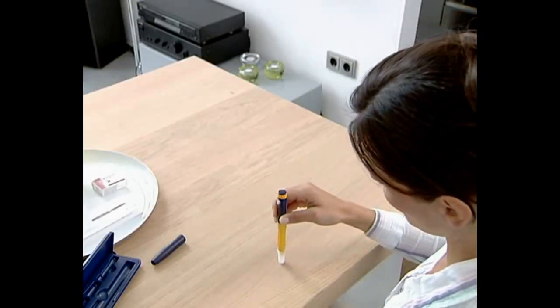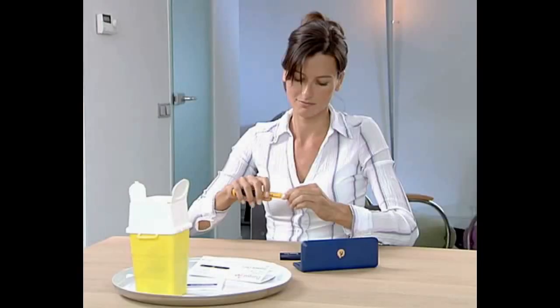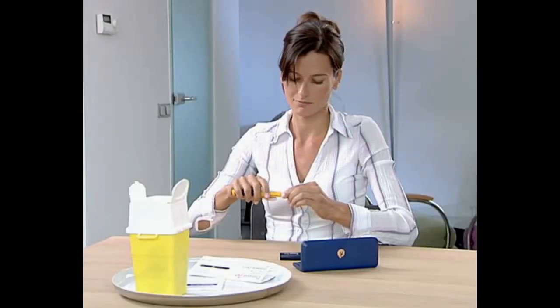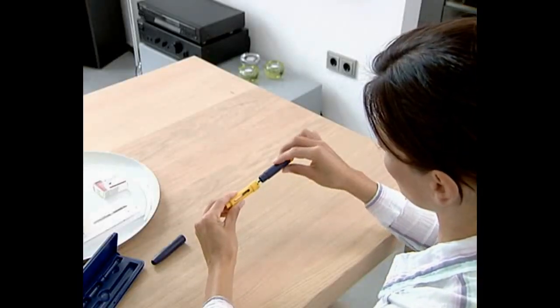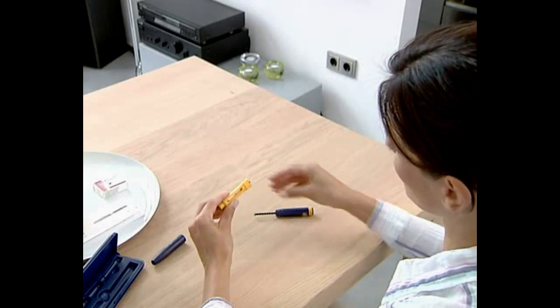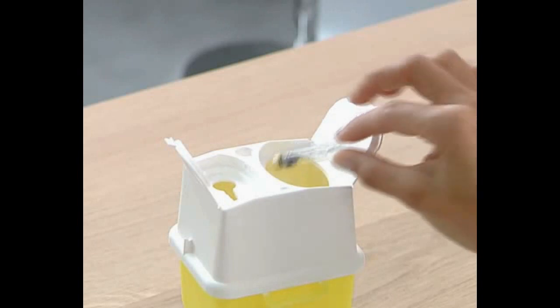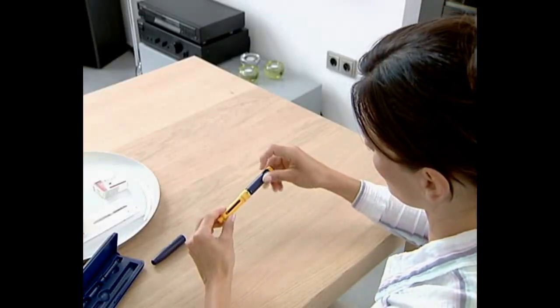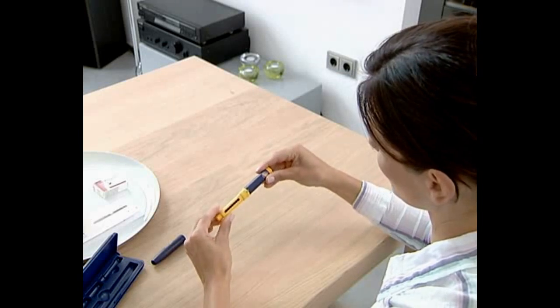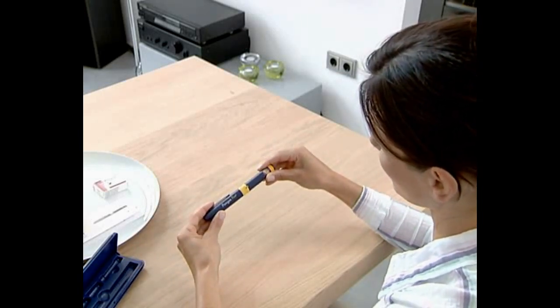Before removing the empty cartridge from the pen, the needle must always be removed, as shown in removing the needle. Unscrew the body of the pen, put down the body, and remove the empty Purigone cartridge from the cartridge holder and place in the disposable bin. You can now either prepare the pen for loading the next cartridge, or reassemble the Purigone pen.